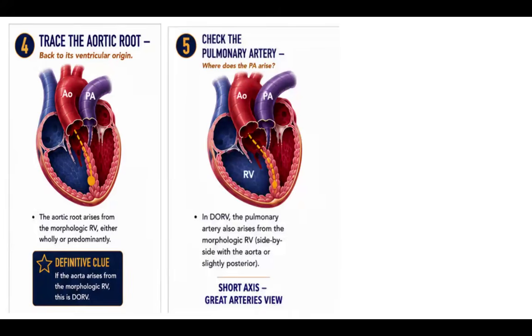And then we're going to compare with the pulmonary artery. Where is it arising? Are you seeing it arising from the left ventricle, or is it also arising from the right ventricle? And so typically in that case, that's when you can differentiate, oh, yes, they're both arising from the right ventricle. And then we can pretty much say, yes, we're seeing a double outlet right ventricle in this particular case.